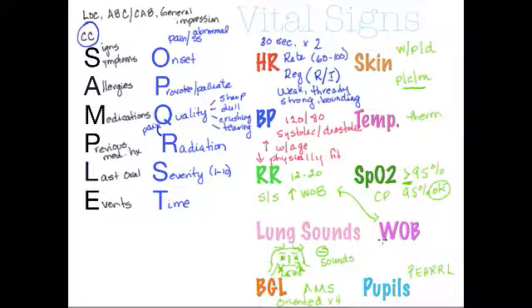Now, when you obtain a blood pressure by hand using a sphygmomanometer, the numbers that you arrive at are always going to be even numbers. A machine may find that the numbers are odd, but those dials are calibrated to only denote even numbers. So don't say you have 123/81, okay? Each little hashtag represents 2 millimeters of mercury.